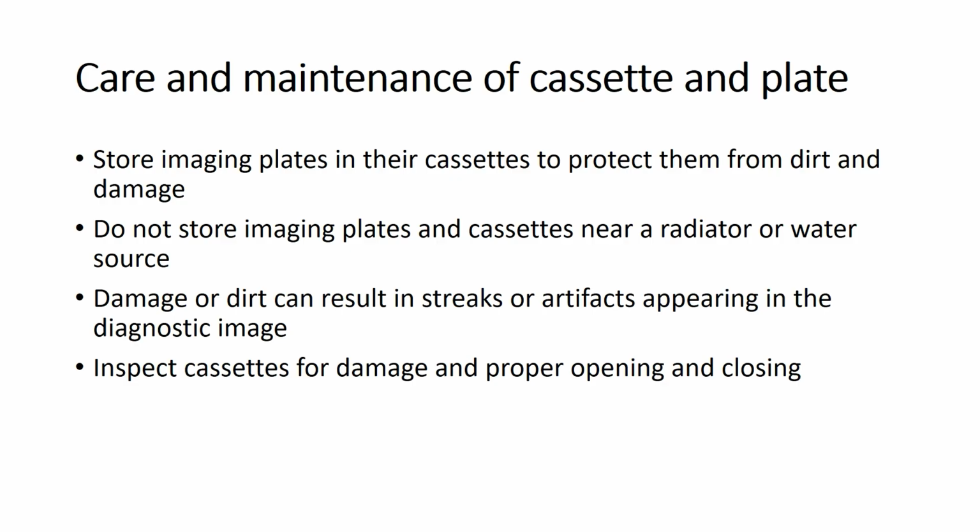Let us discuss the care and maintenance of the cassette and the plate, because as you know, we are dealing with animals. Sometimes the animal may urinate, defecate, and give some dirty things over the cassette, so care and maintenance of the cassette and the plate is a must.